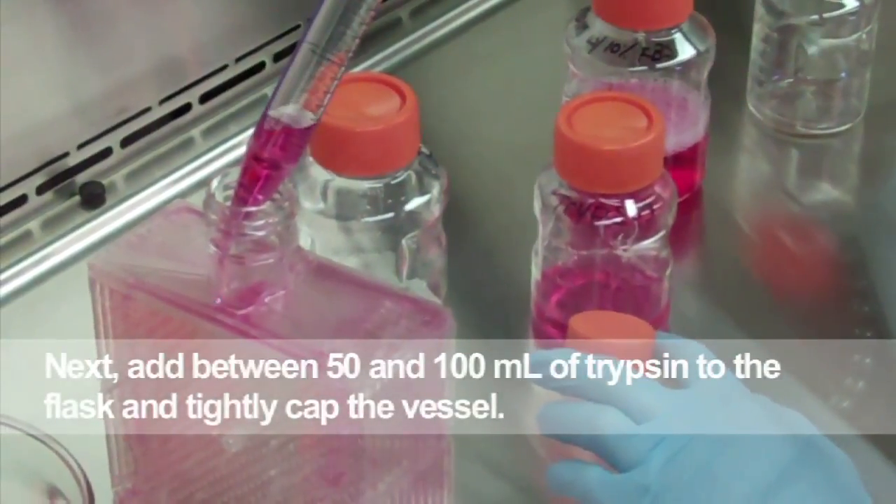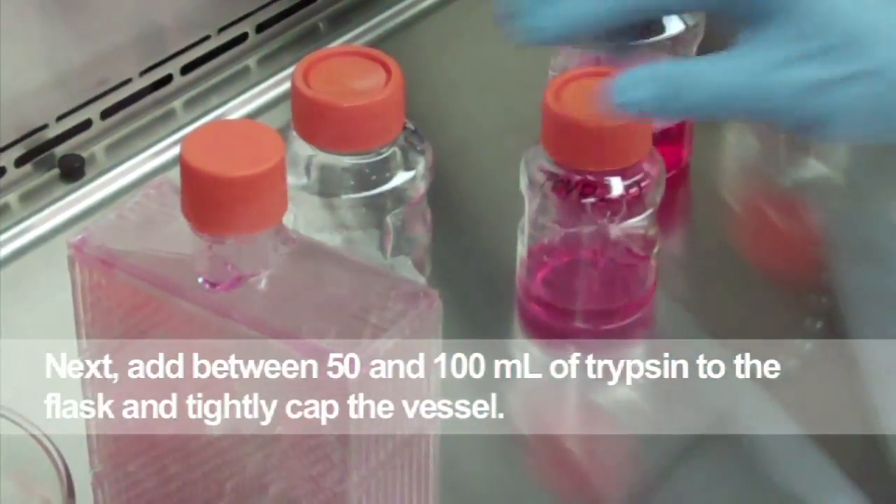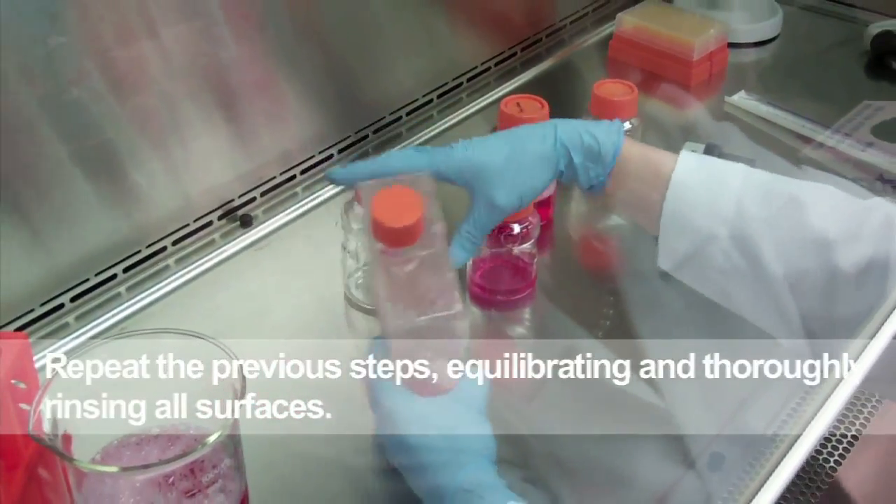Next, add between 50 and 100 milliliters of trypsin to the flask. Tightly cap the vessel and repeat the previous steps, equilibrating and thoroughly rinsing all surfaces.